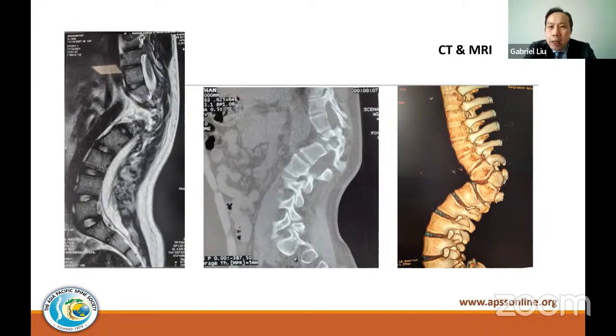And there are three hemivertebrae there, or abnormal vertebrae there. I would probably just take the apical one, and then by doing so, reduce some of the kyphosis. And then the levels above and below, I would put Ponte osteotomies to smoothen the correction, to make a bit of release.